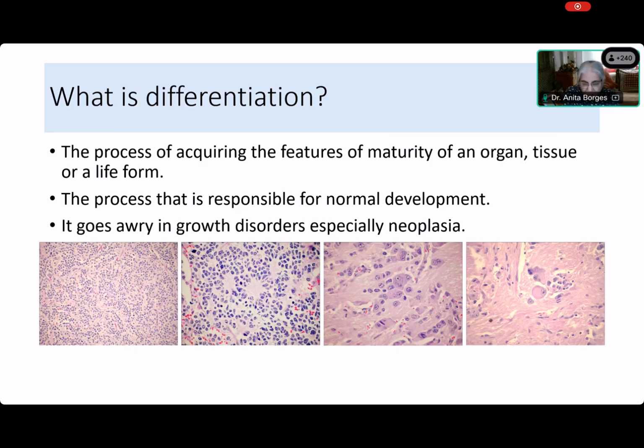In the center, of course, there is something. Maybe you can't see it very well. But if you had a gland, say this was all something that looked like a cribriform space, and if there was an outer part to this, suppose this is the outermost part of this gland, should there not be some kind of limiting membrane that tells you that something is a gland? It isn't there. So this is not a gland, and you have very rightly now, Lalit, called it a rosette. Very good. So these are rosettes.